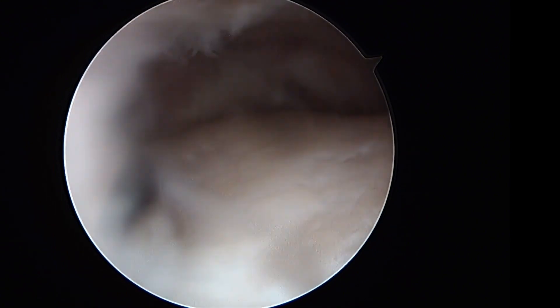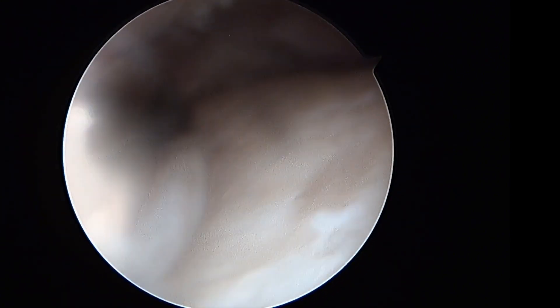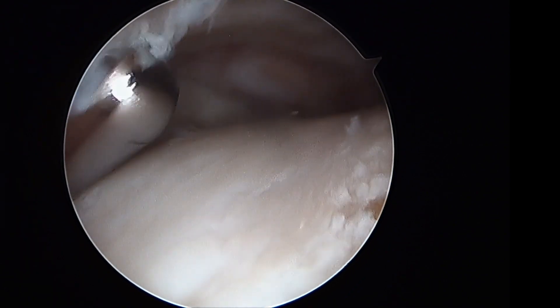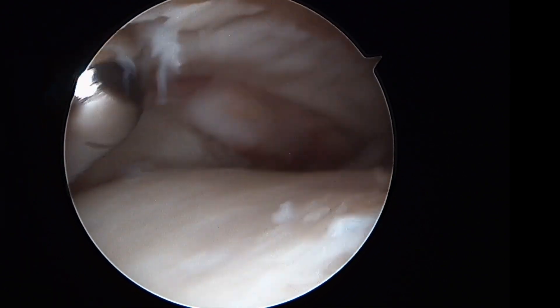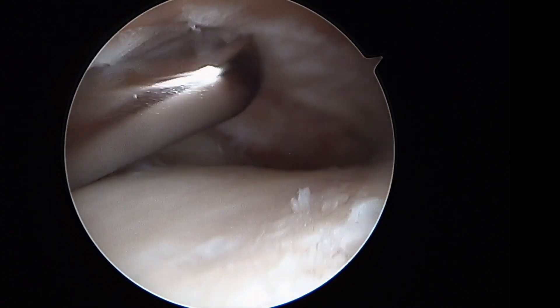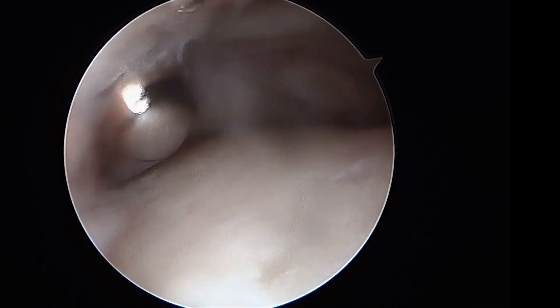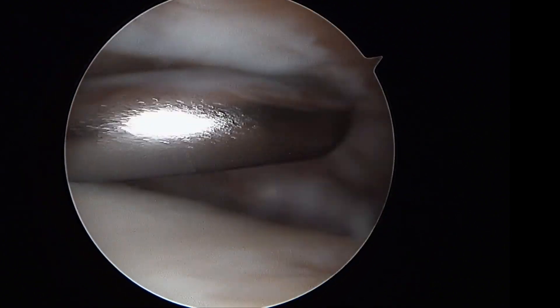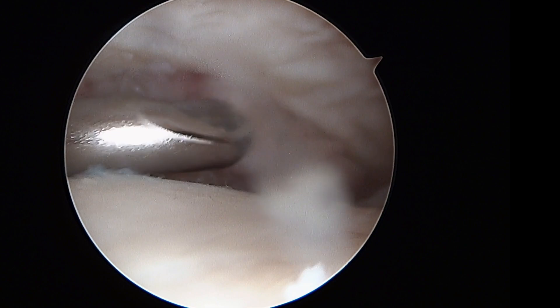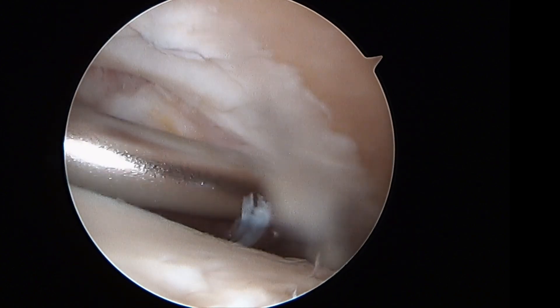Starting from the medial aspect and progressing laterally, soft tissue is cleared and all cartilage on the tibial side is removed as thoroughly as possible with the full radius resector, including at the back of the tibia. There is some synovitis at the back of the ankle joint.